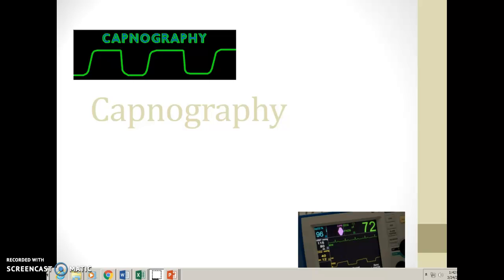If you are listening to this lecture, again, this will be a lecture for Unit 7 over capnography. Capnography covers different terms, and you may hear all of these used interchangeably, but it measures our end-tidal carbon dioxide, so end-tidal CO2. You may see it written as PetCO2, which is partial pressure of end-tidal carbon dioxide.